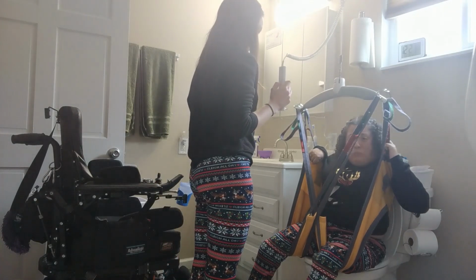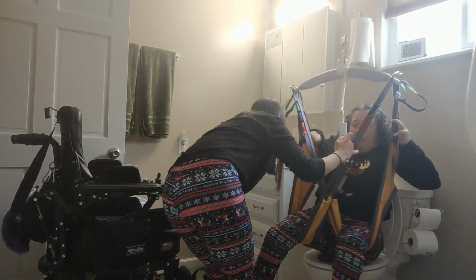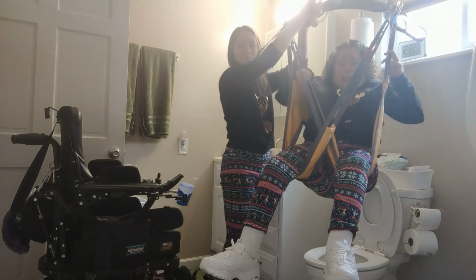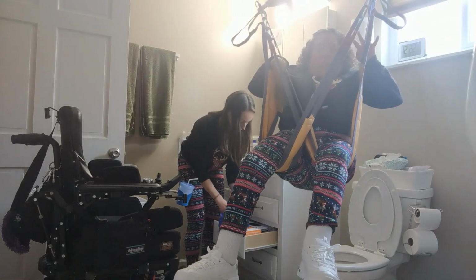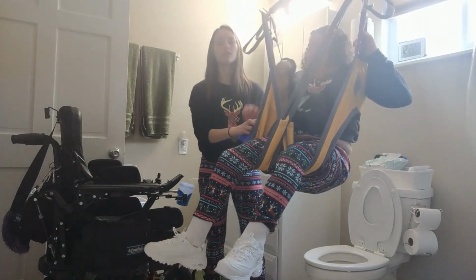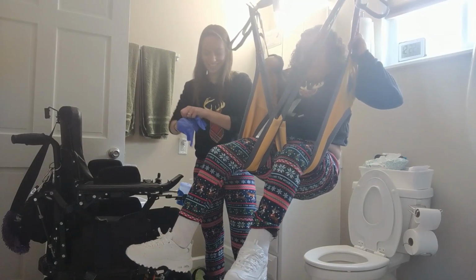Now this next part I want to show you is specifically related to my personal care, like the wiping and drying process. Most people just use the coveted TP, they wipe, they drop it in the toilet, they flush, and hopefully they wash their hands afterwards. But for me, I have a propensity to get urinary tract infections, or UTIs, so to avoid that, we do a 2-step wiping process. Make sure you wear gloves. Right. Because hygiene first, folks.